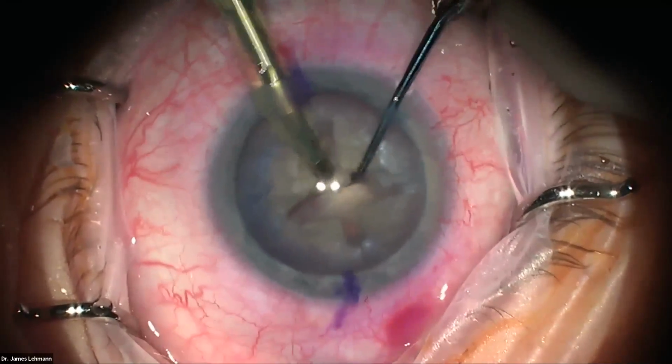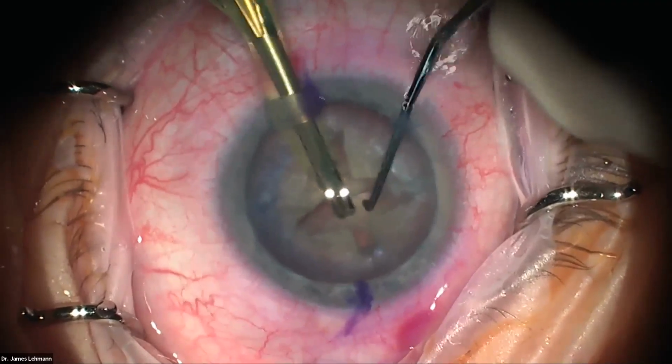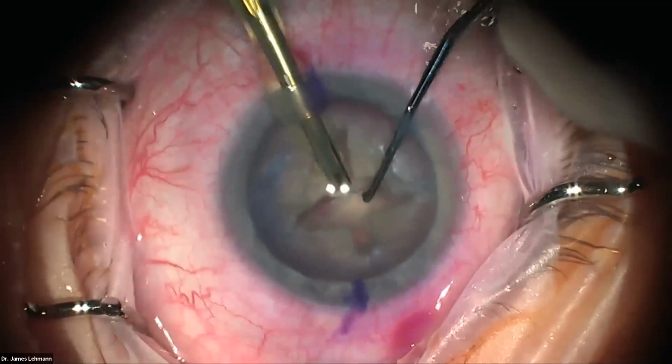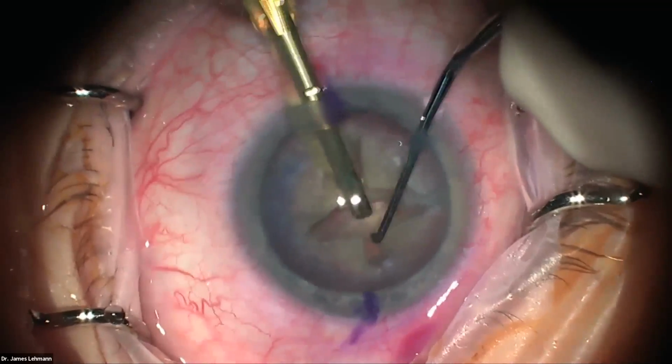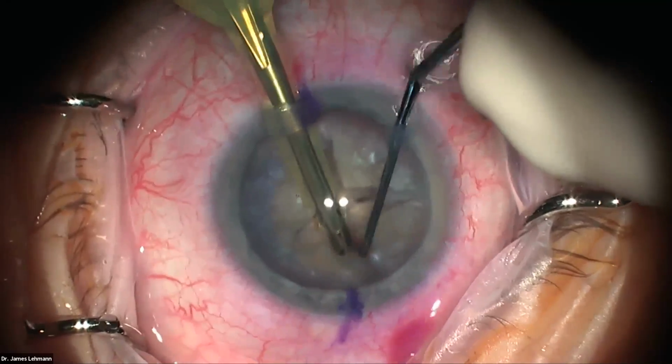And now, if I had removed these two quadrants and then I just tried to do what I did there by doing a groove in the last one, it would be moving around all the time because there would be no other pieces trying to stabilize it. So especially beginning, do all your quadrants before you remove them. It's just going to make life easier.